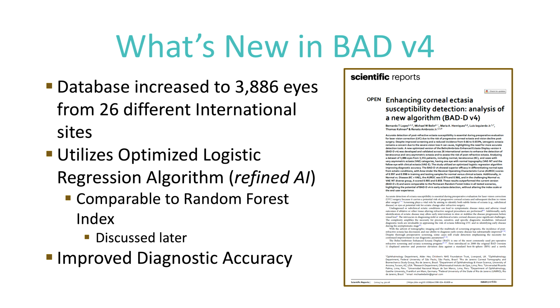What we found is that using a logistic regression analysis, the overall performance was equal to the random forest index without having to change the end user experience, which is critical. You can imagine if you went into your car one day and all the controls were changed, that's a major problem for you. So we were able to improve the overall function and both specificity and sensitivity while keeping the end user interface the same.